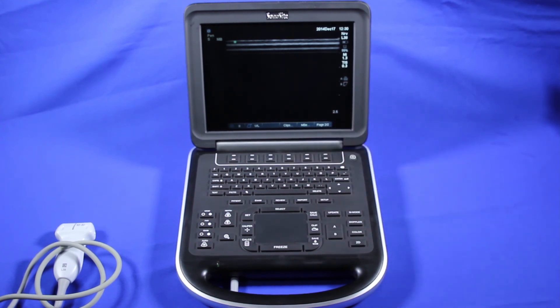And that's general information about the SonoSite Edge ultrasound machine. Next, we'll get into imaging, saving, measurements, and annotations.